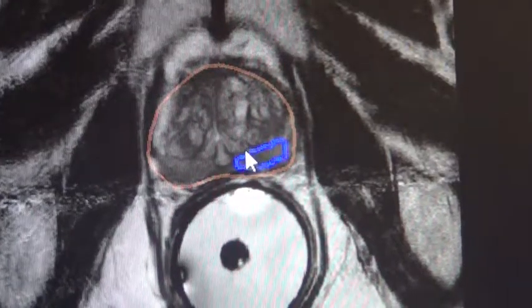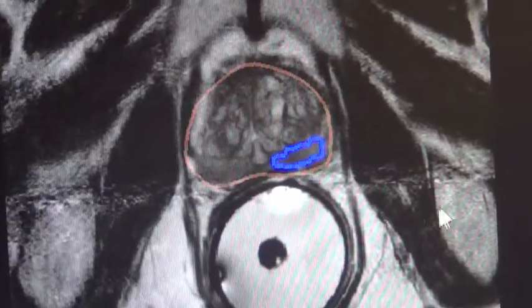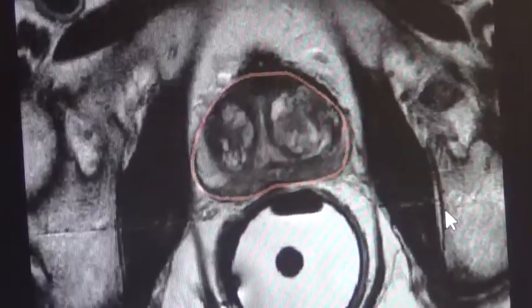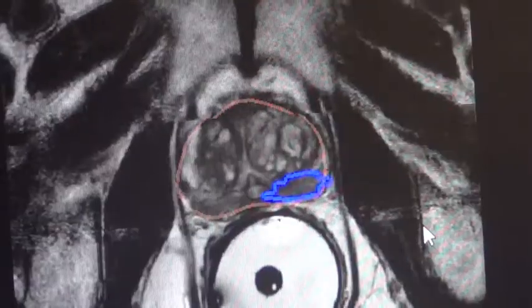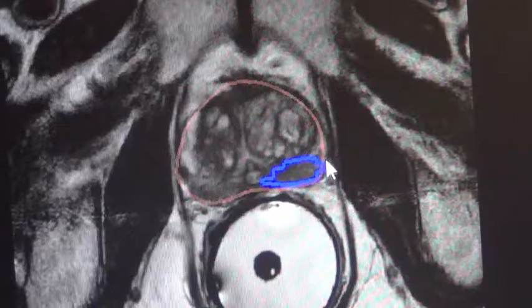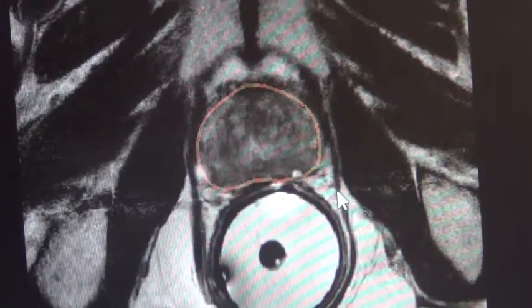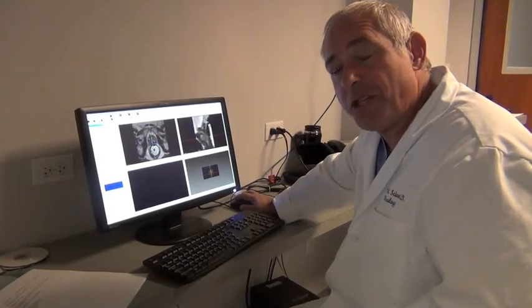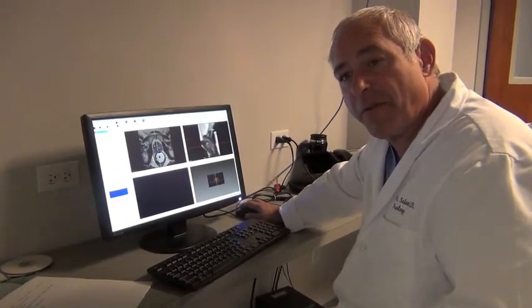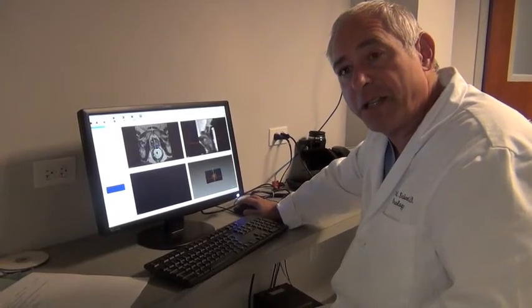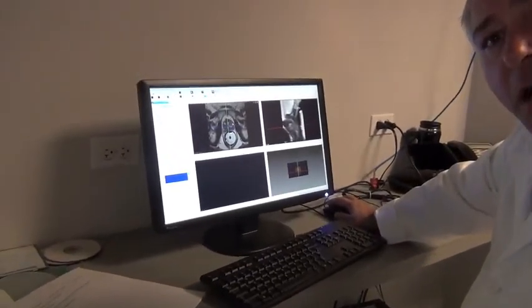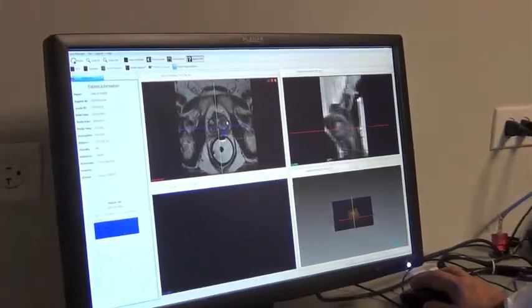Additionally, we've identified regions of interest or abnormality corresponding to the radiology report. The prostate gland is reported in the mid-gland region between the 5 o'clock and 3 o'clock position to be focally abnormal on the T2-weighted image, and that corresponds to deficiencies in diffusion. I've outlined the regions of abnormality by referring back to my radiology colleagues' interpretations. Now we're going to export this image file onto a disk and load that into our Artemis device.